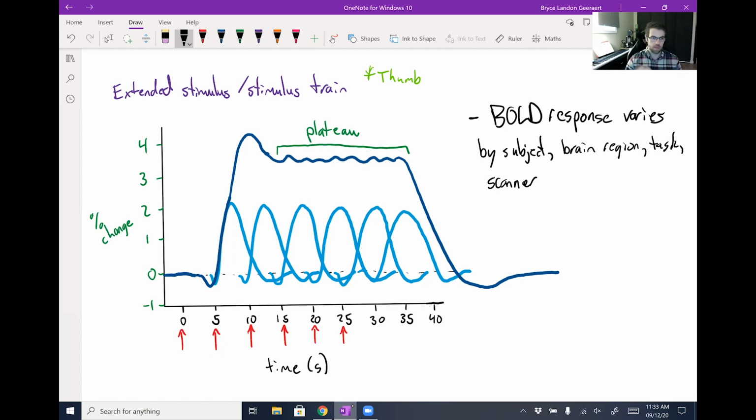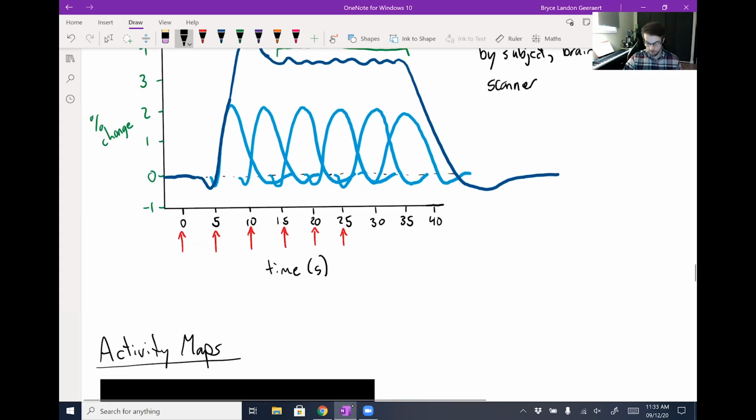And that comes back to that SNR discussion and the quiz we had last time, where if you average multiple images, noise can cancel itself out a little bit.